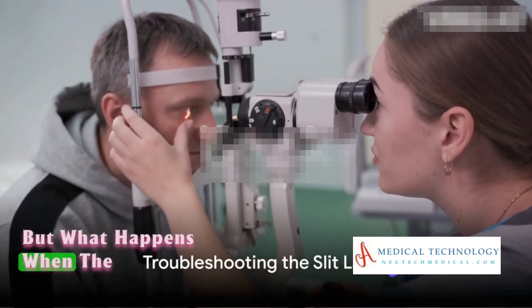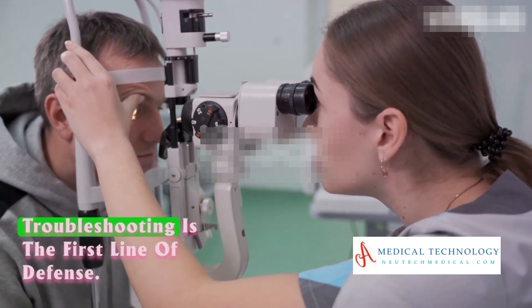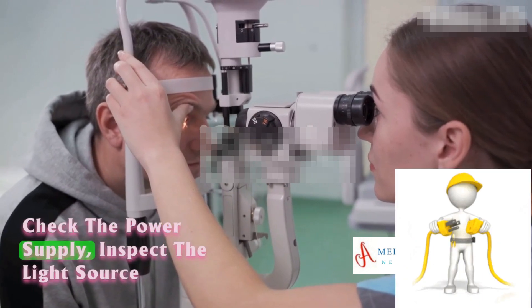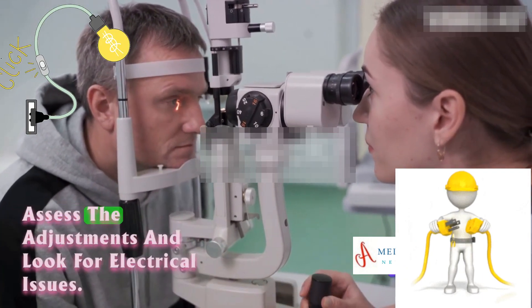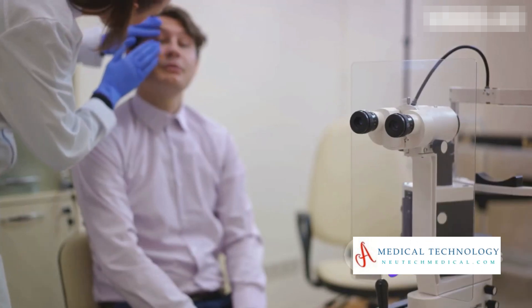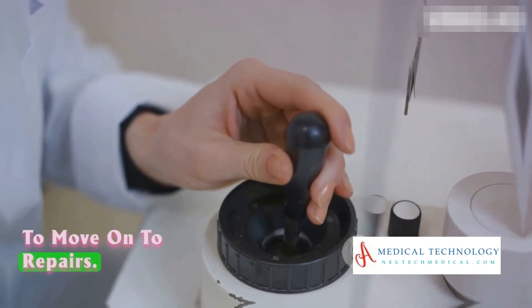But what happens when the slit lamp encounters a hiccup? Troubleshooting is the first line of defense. Check the power supply, inspect the light source, assess the adjustments, and look for electrical issues. If the problem persists, it's time to move on to repairs.